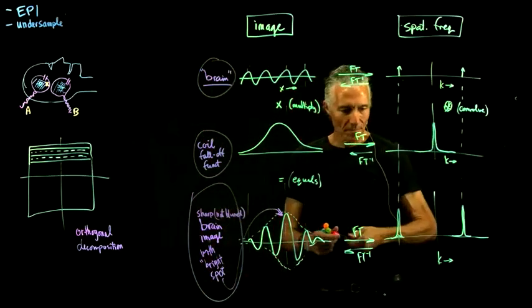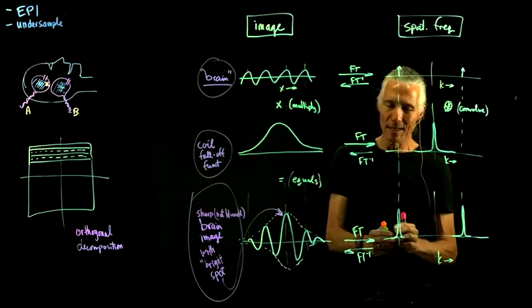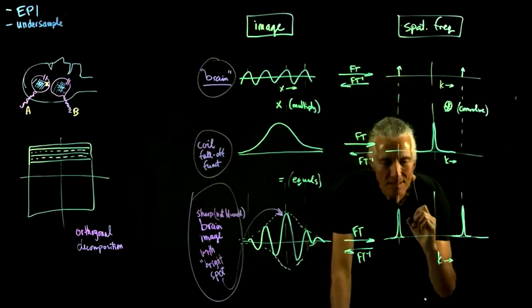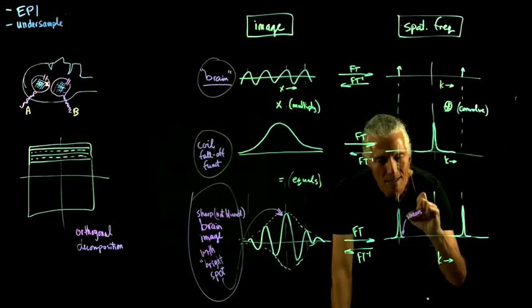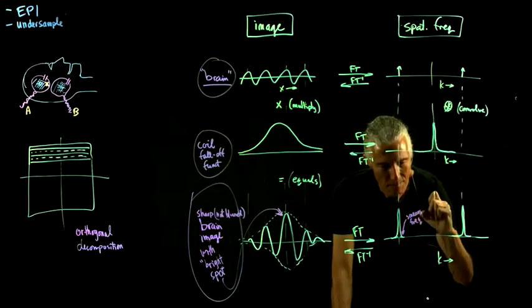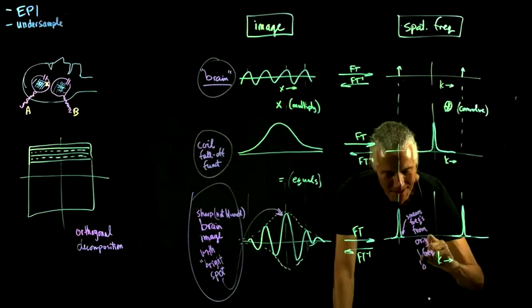But what have we done in K-space? We kind of smeared out the data. It smears frequencies from the original one-frequency brain.